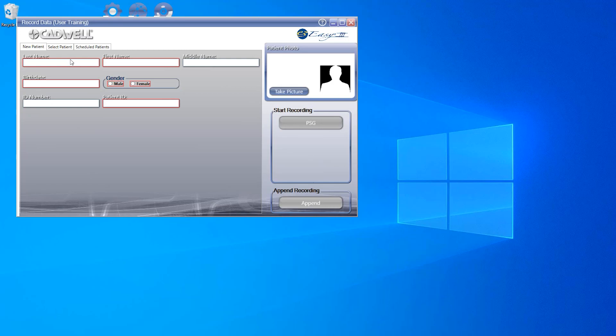We will start with the New Patient tab to enter our patient information. You will use this tab if the patient is new to your sleep lab, you do not have an interface with your electronic medical record or EMR, and you do not use the CADWL scheduler. You will see some fields require you to fill in information before allowing you to select the appropriate study recording button.